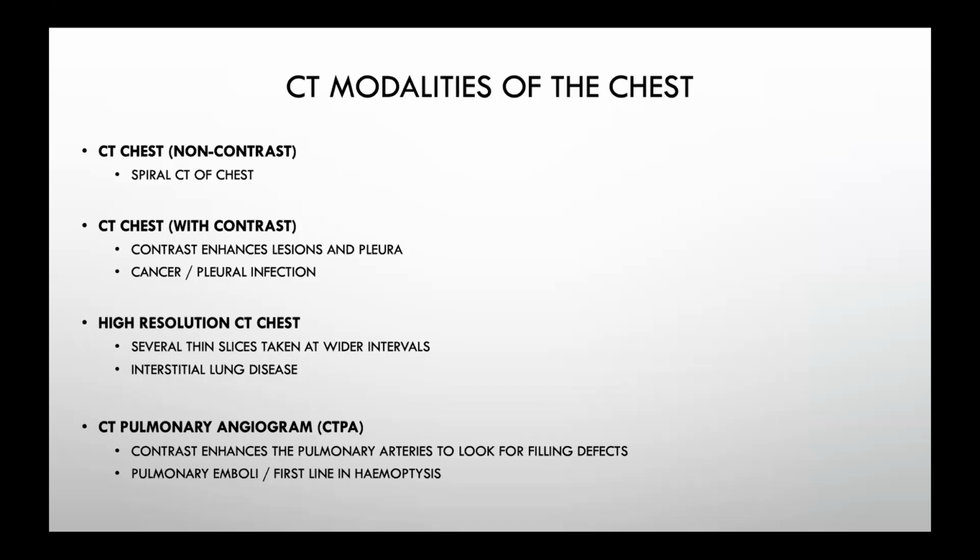A CT chest with contrast enhances any tumours or masses or vascular lesions, and it also enhances the lining of the lung, which is pleura. And you're looking mostly for cancer and infection. That's what enhances with contrast on a CT chest with contrast.